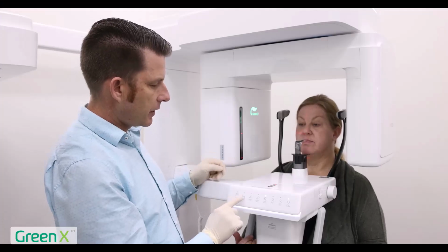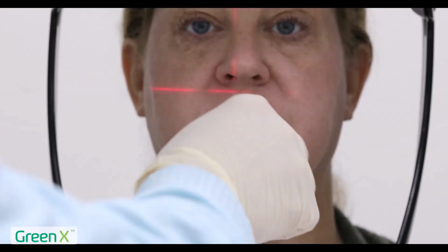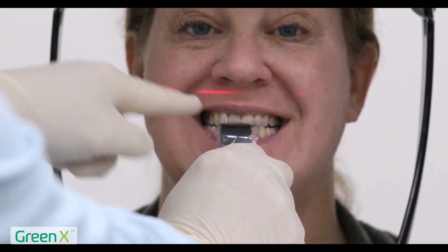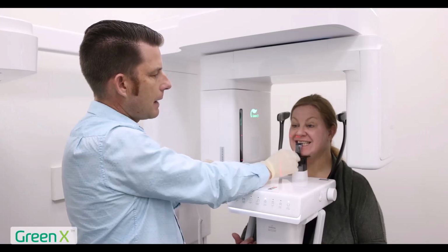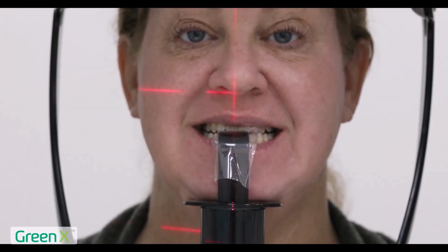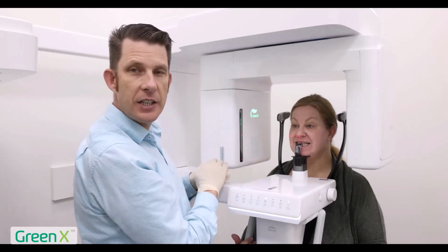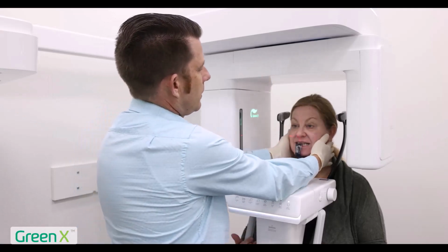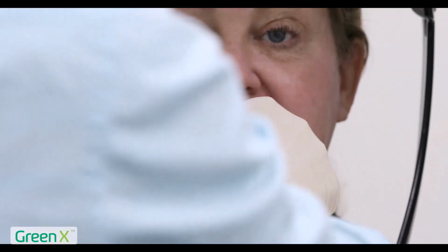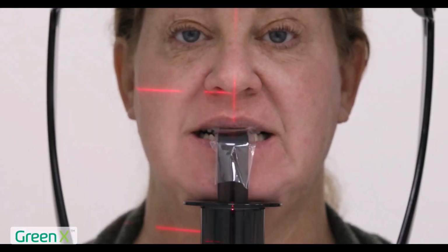In this case, I need to bring the column down a little bit. Go ahead, open and bite on the bite stick. Smile really big. I can see the patient's biting in the bite stick groove. I'm going to push down on the bite stick to ensure the chin is on the chin rest. Next, I'm going to make sure the patient is lined up center. We're going to go ahead and get you lined up center here. Perfect. Chin's on the chin rest.